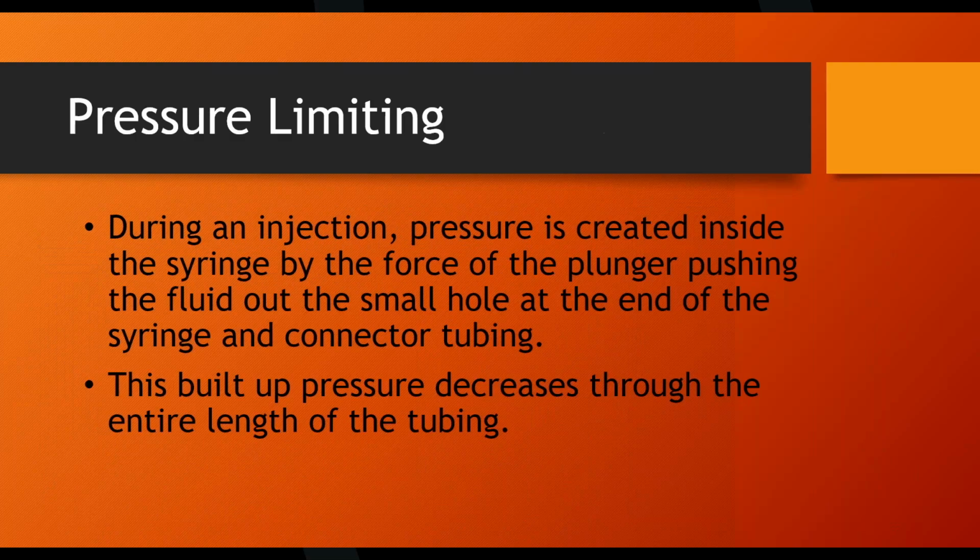All right, so getting on to the equipment. I'm going to stray from the presentation a little bit. This right here is the Stellant. This is a CT injector. This is by far the most common CT injector in the world, the MedRad Stellant. There is a newer version of this called the Stellant Flex, but it's pretty much identical. They just updated some of the internal stuff, but externally it's pretty much exactly the same.